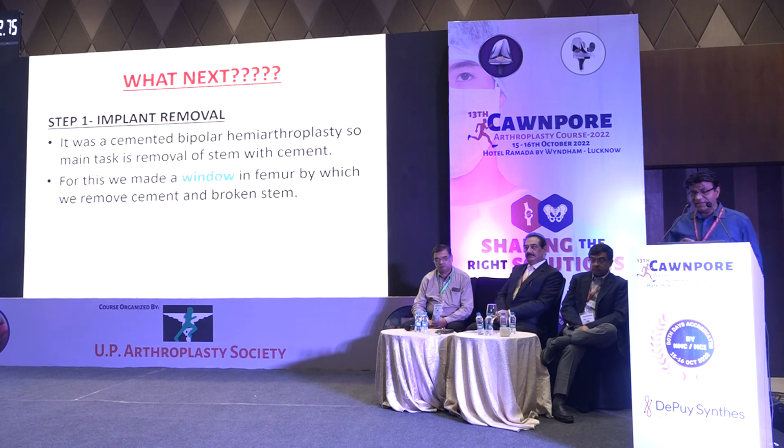For this, we need to have an ETO or make a window in the femur by which we can remove cement and the broken stem. Initially, we have various methods, like an antegrade method. And my suggestion is, when you approach or go for these cases, don't hesitate. Have a good exposure. Have a good exposure.